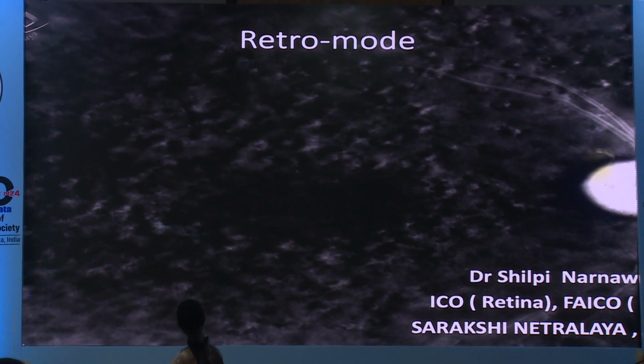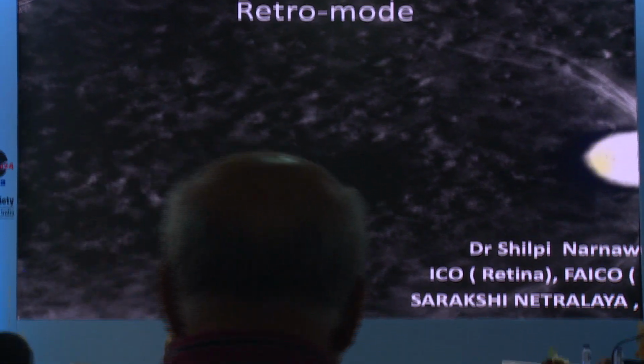Great presentation, Shane. Especially when you pointed out the small pupil, we get so many situations where children walk into the clinic and are very uncooperative with an indirect ophthalmoscopy. You put them on and take a picture, and in these cases, even if you go to the IR image, don't even go for the color image, the IR image, there's no light coming out, and you're able to document the entire fundus. So it's extremely useful in these cases.